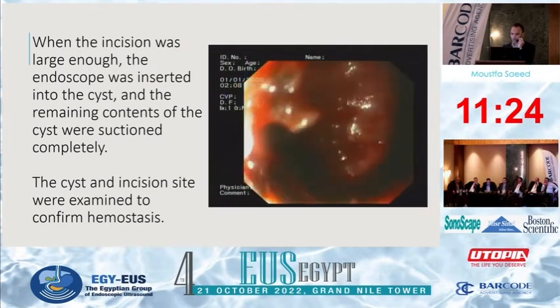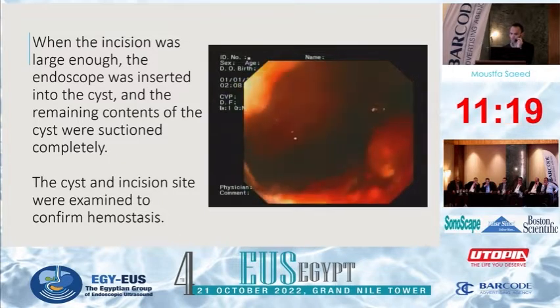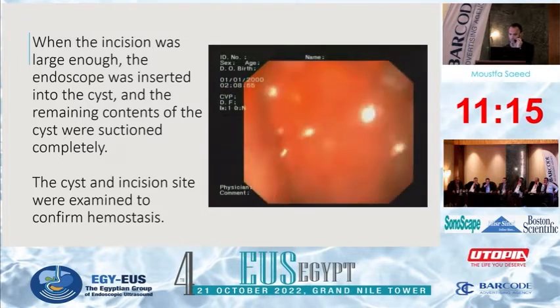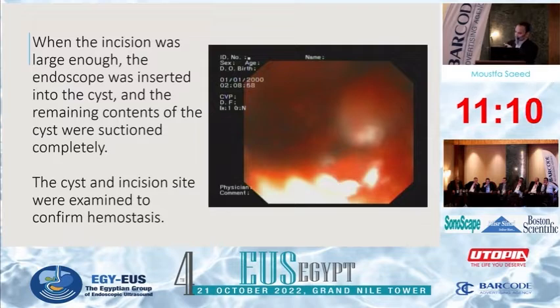When the incision was large enough, the endoscope was inserted into the cyst, and the remaining content of the cyst was suctioned completely. The cyst incision site was examined to confirm hemostasis. This is a view of the upper endoscopy inside the cyst.